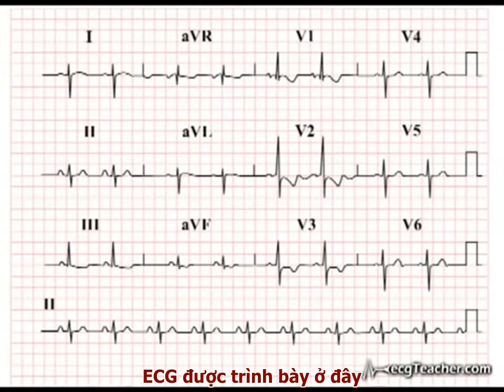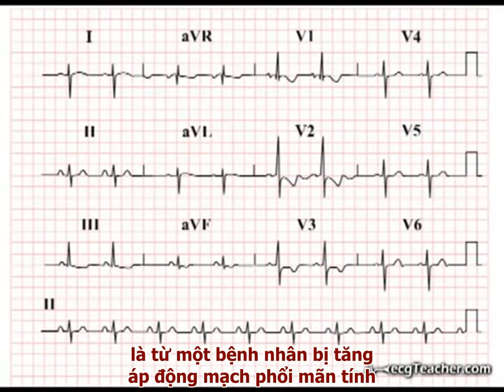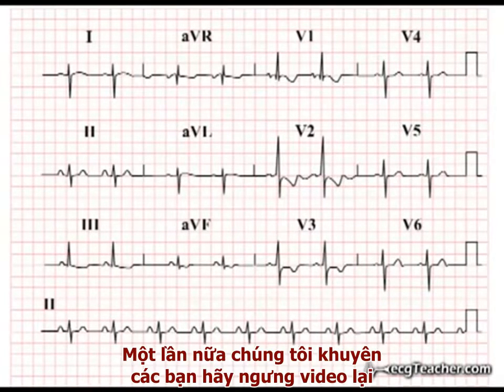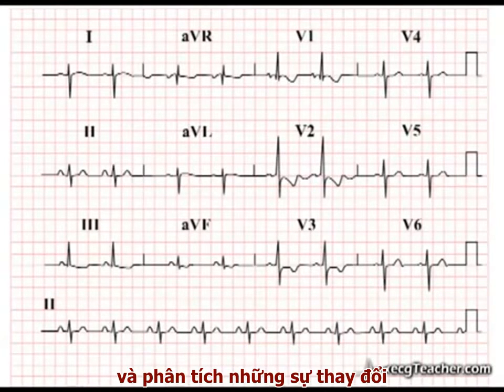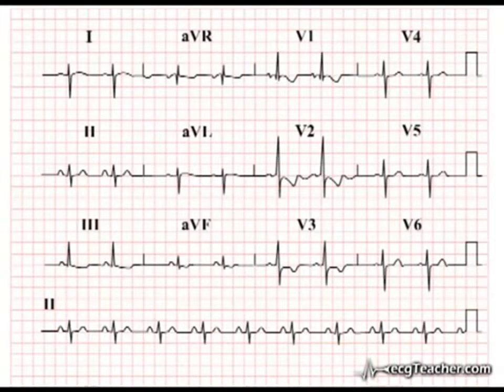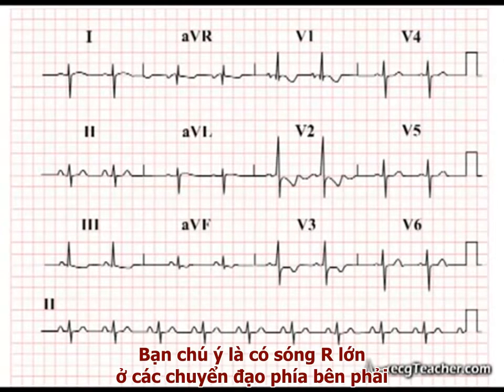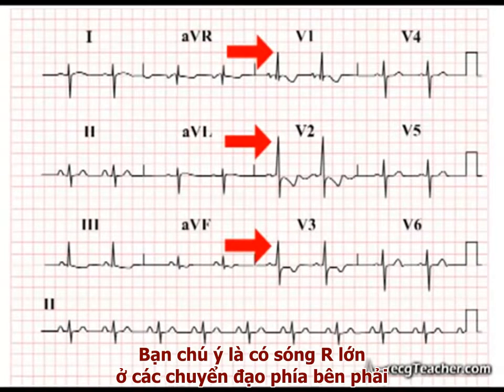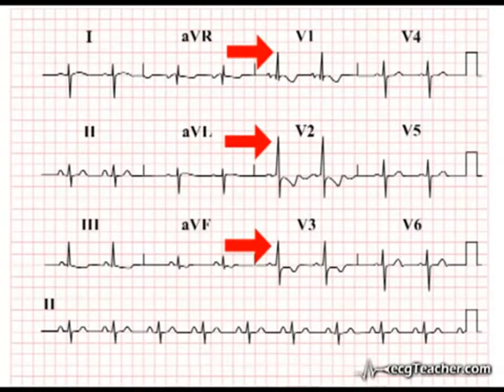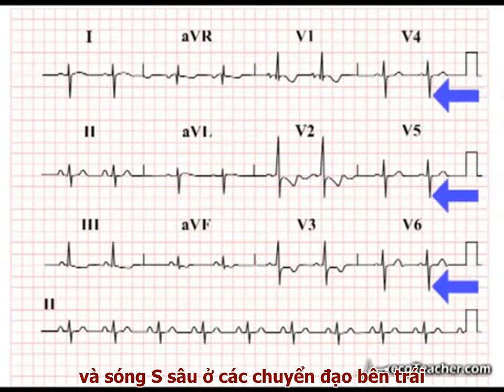The ECG shown here is from a patient with chronic pulmonary hypertension. Again, we would invite you to stop the video at this point and analyze the changes present. You will notice the prominent R waves in the right-sided chest leads and significant S wave activity in those on the left.